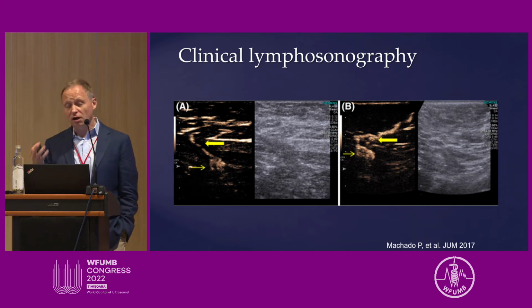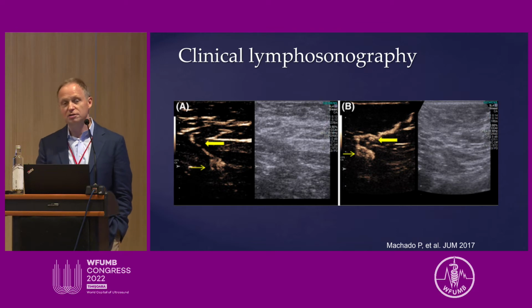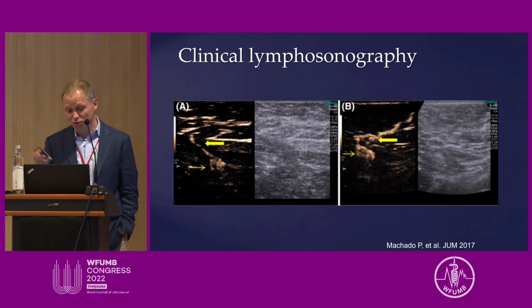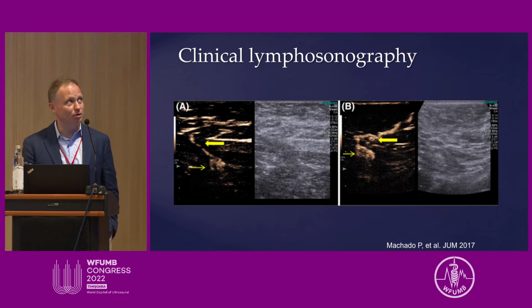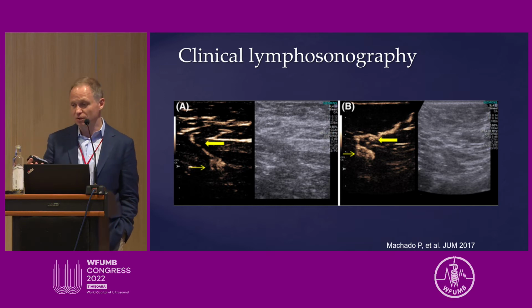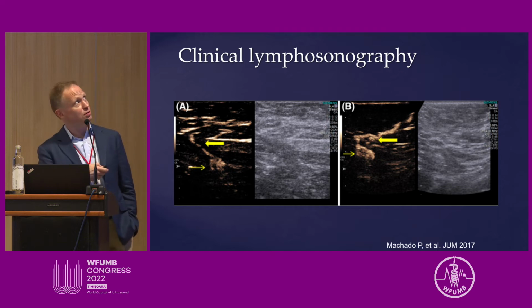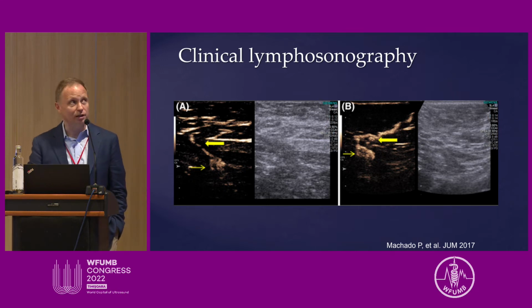And we can find lots of small, tiny lymph nodes in the large breast and in the large axilla in a patient with very fatty tissues. It's a challenge. You've been there. A massively abnormal lymph node with no fatty hilum and a 2-centimeter lymph node with round morphology, that's easy, but those 7, 8, 10 millimeter lymph nodes, especially when they have fatty hilum, are quite a challenge.